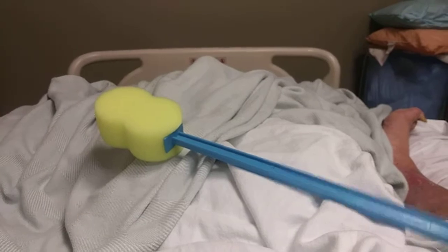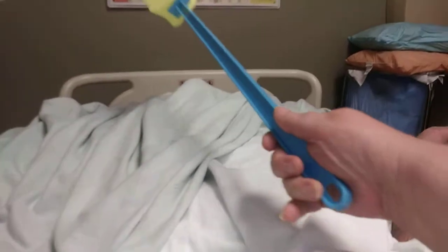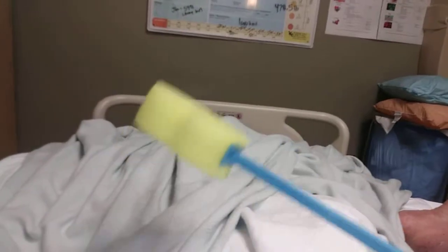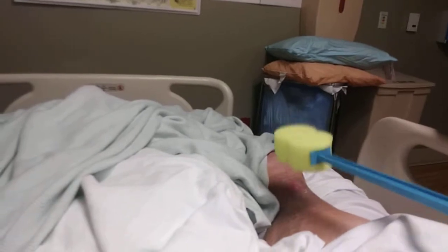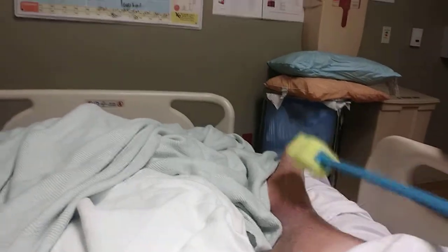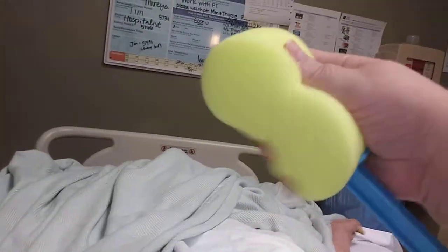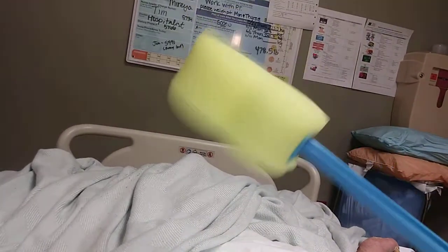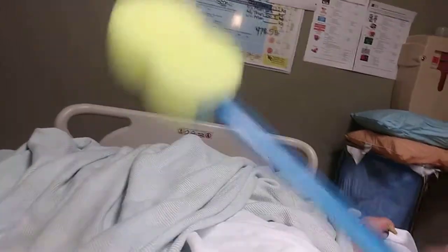Okay, I had to get everything out of my way so I could present each thing to you properly without everything being in the way. Okay, so what this is here is a sponge for bathing from a distance. Okay. Anyway, so this is so I could reach my feet and whatever, in between the toes. I'm not going to touch my feet with it right now because it's absolutely brand new and it feels good and I like it. But I'm not going to just go and dirty it up with my feet. Anyways, this is what that is.